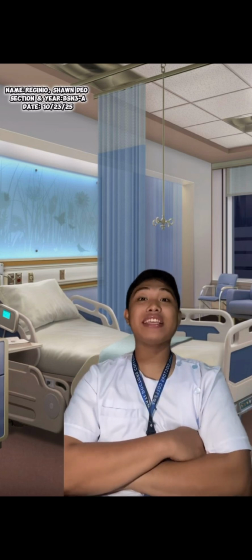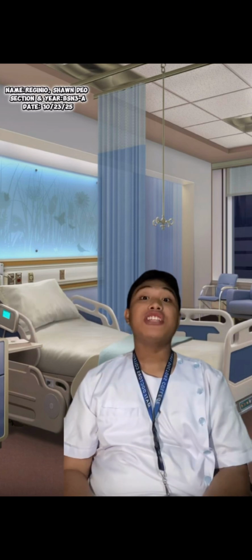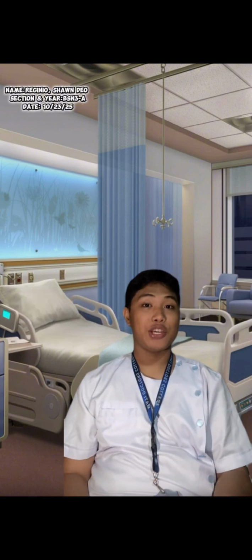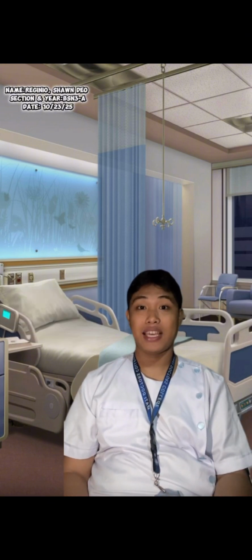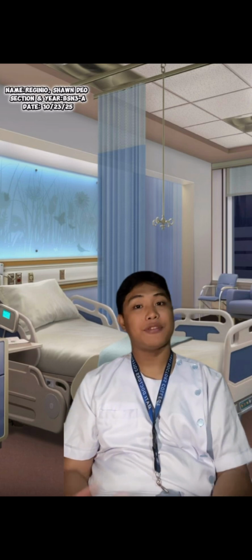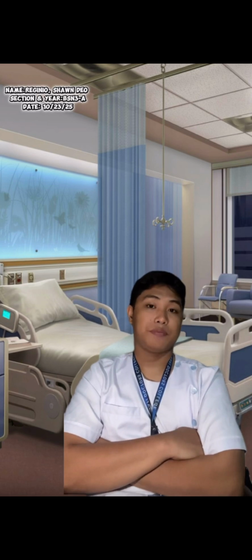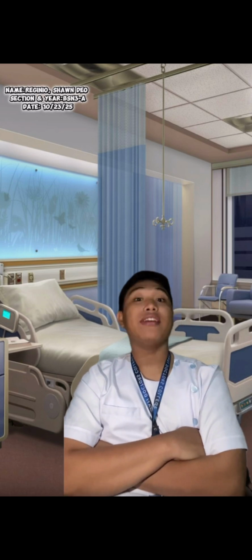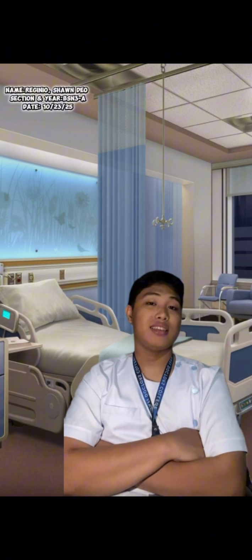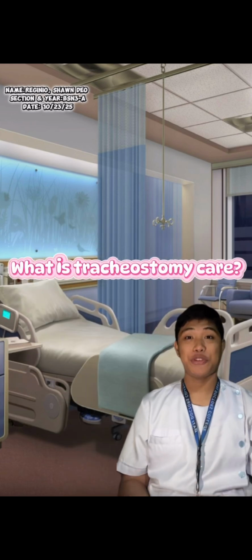Today I will be sharing something very important in nursing care: tracheostomy care. In this video, we'll learn what a tracheostomy is, the equipment used, the proper procedure, and how we care for a patient with a tracheostomy. So sit back, relax, and let's make learning more fun and easy, nursing style. What is a tracheostomy?